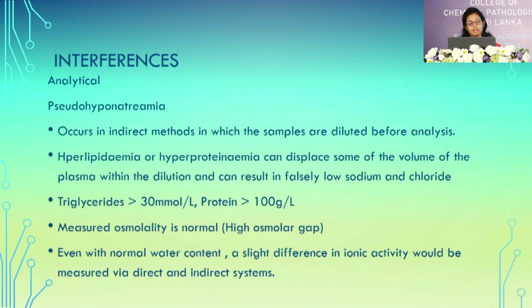Again, remember, even with normal water content, there can be a slight difference between the electrolyte results from the direct and indirect method. There can be a slight difference.